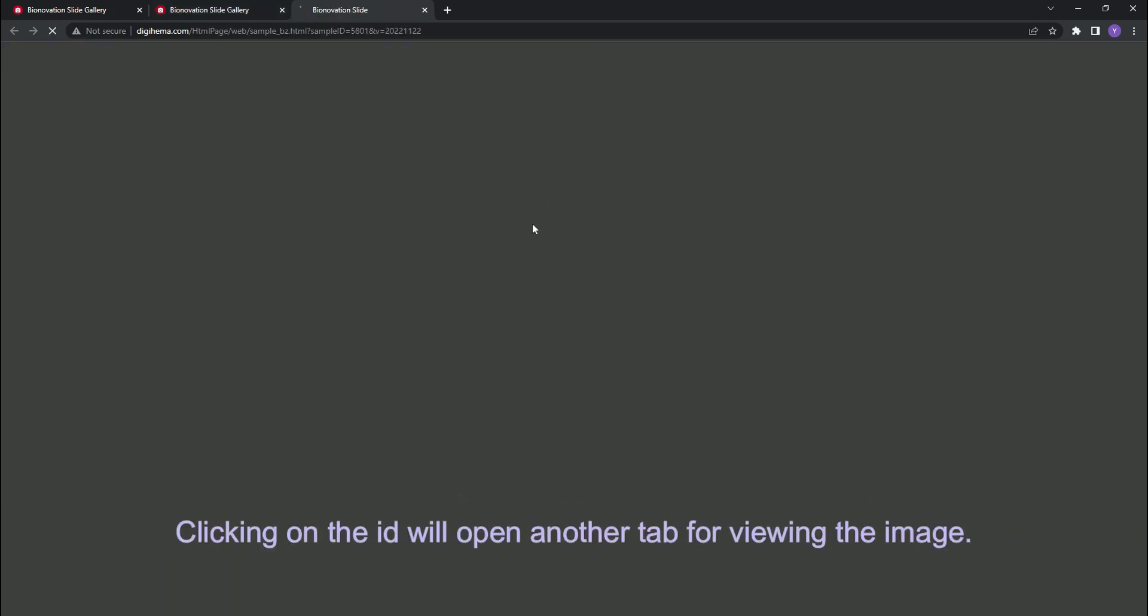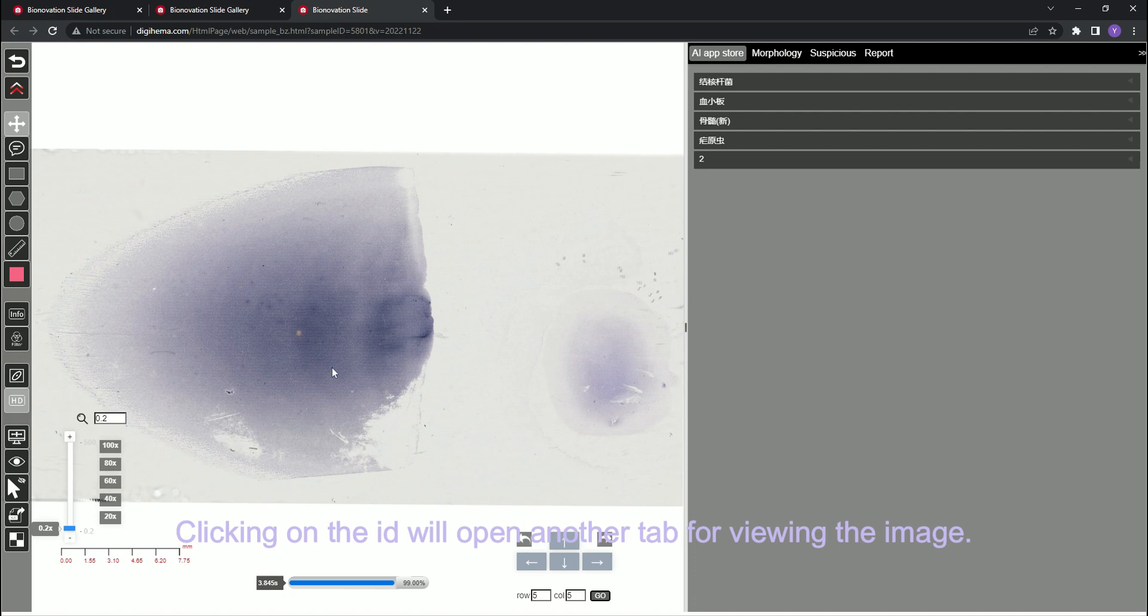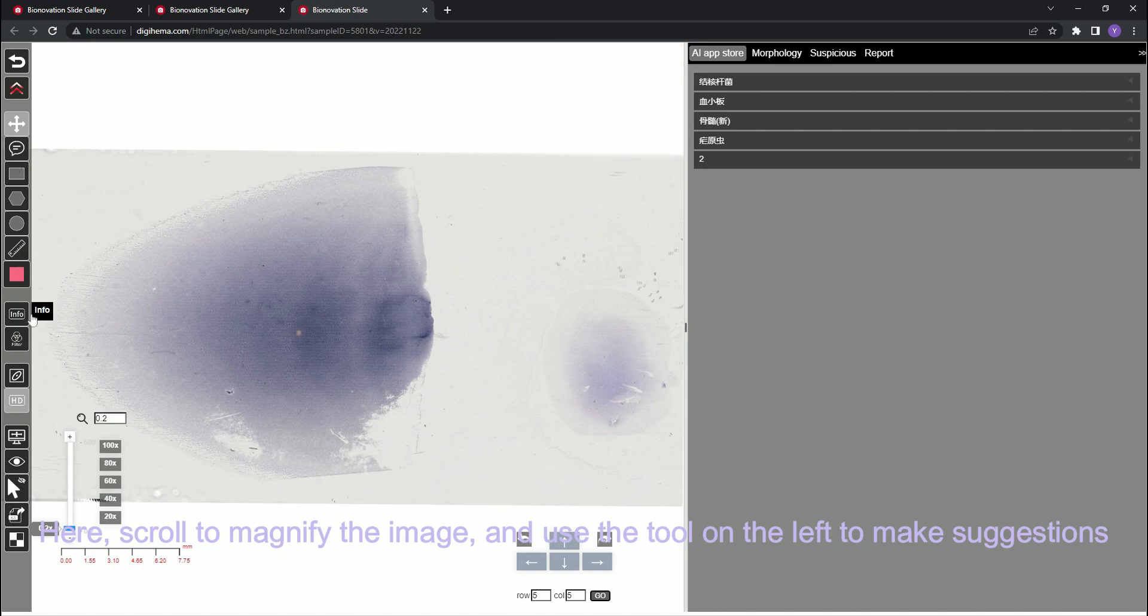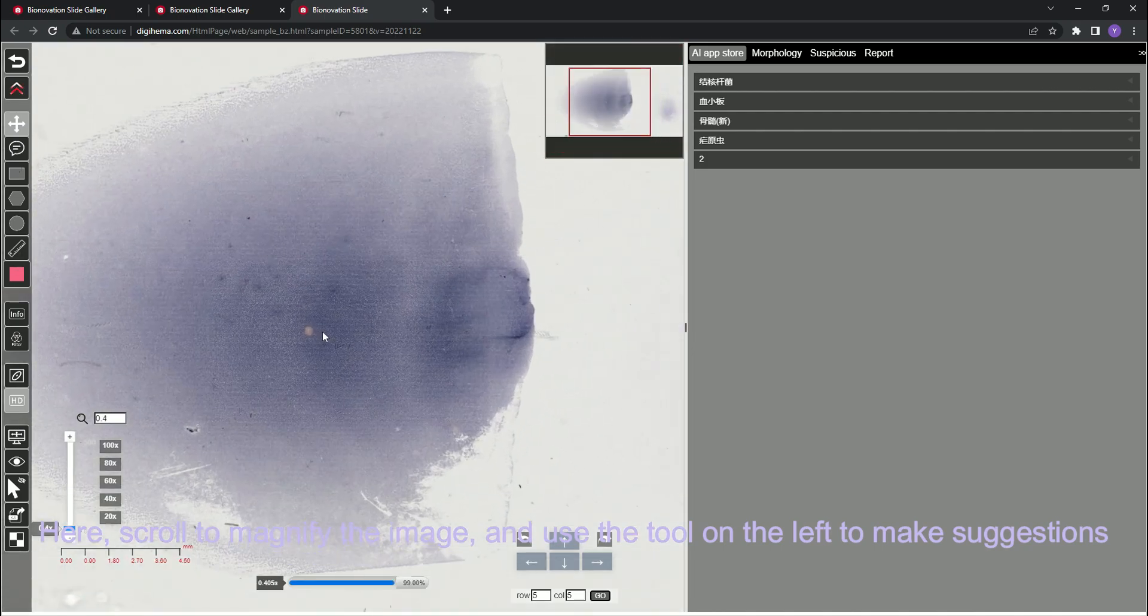Clicking on the ID will open another tab for viewing the image. Here, scroll down to magnify the image and use the tools on the left to make suggestions.